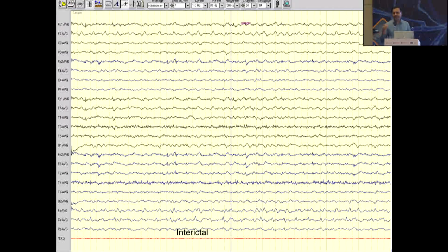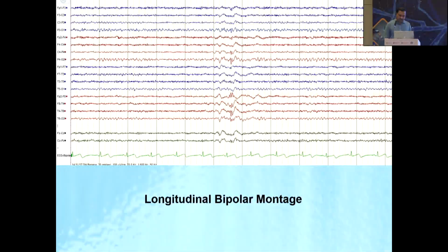So the average montage definitely provides more information, but it is a difficult montage to use and requires some experience. So always initially look in the bipolar montage when you start reading the EEG, and in cases of difficulty, try to switch over to the average montage. But gradually, over the last many years, my primary montage is now the reference montage, because that definitely provides more information and the chance of missing anything is less. So you can gradually change your comfort zone.